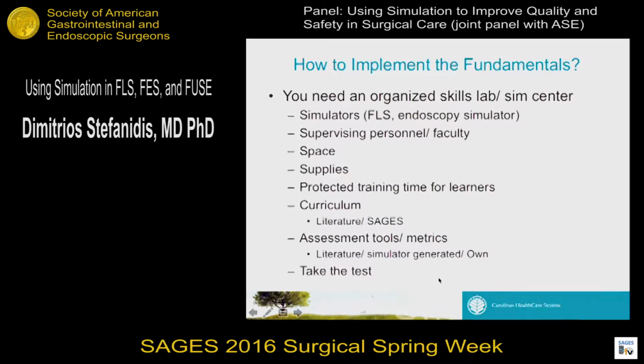So the last thing I'm going to address is how to implement the fundamentals. Well, there's a number of things you do need. There's no question about this. You essentially need an organized approach and probably a skills lab or a bigger simulation center.